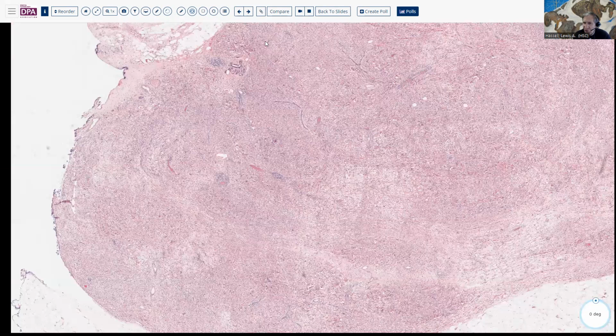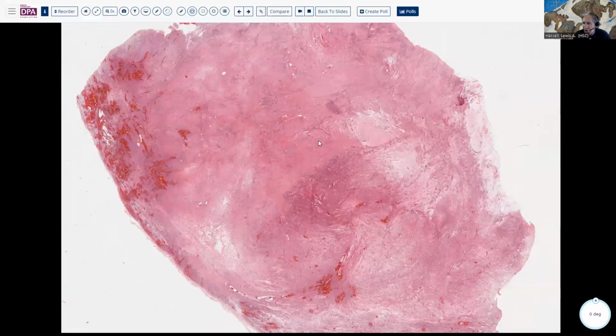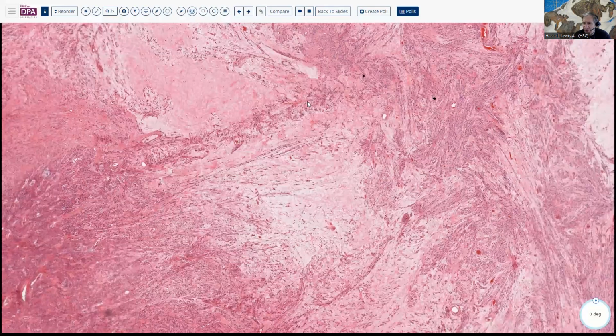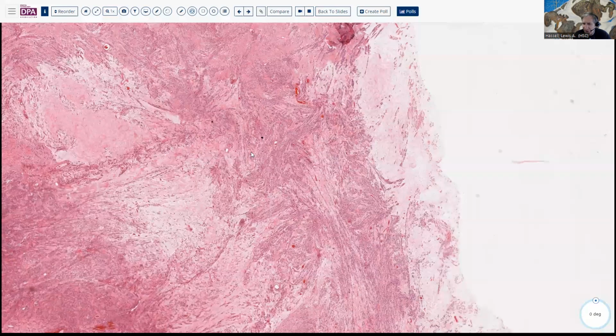Generally fairly well circumscribed, this one occurring in the breast, as you can see here. But as I've mentioned, they can occur along the milk line. Here's one that occurred in the vulva. And you can see some variable degrees of myogenic type appearance. So it almost resembles a little bit of a leiomyoma with myxoid degeneration in some areas in a lesion like this.